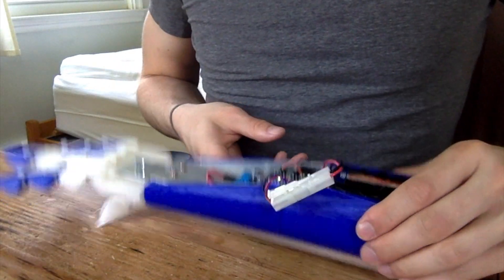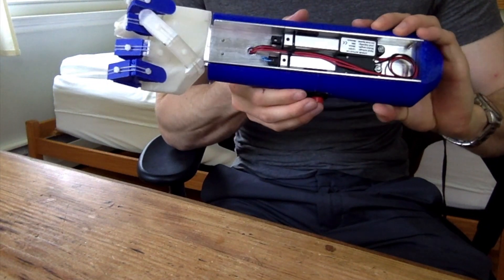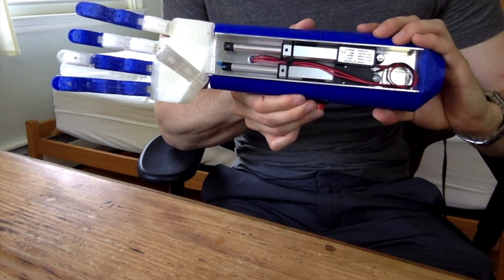After hooking everything up and connecting the battery, the hand opens and closes at the push of a button. Remember, the button is just for us for testing. In reality, a user would use the muscle sensor that we tested in part 2 and demonstrated in part 3.